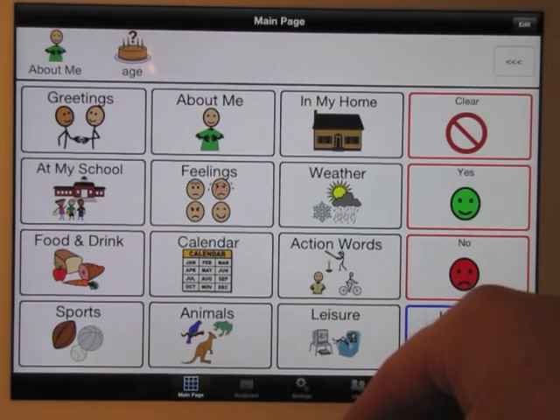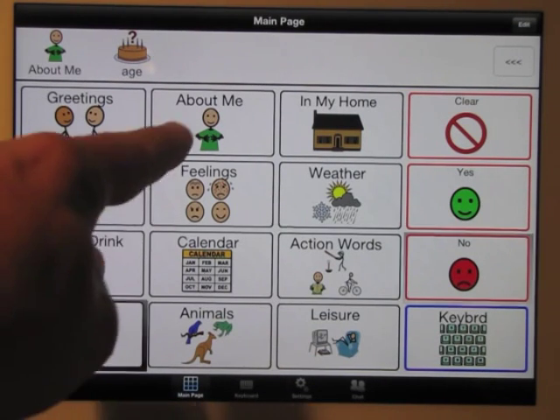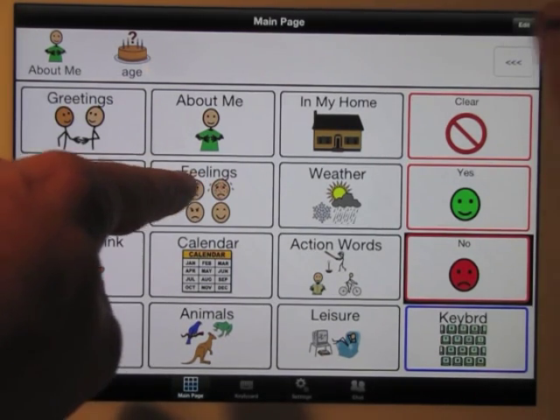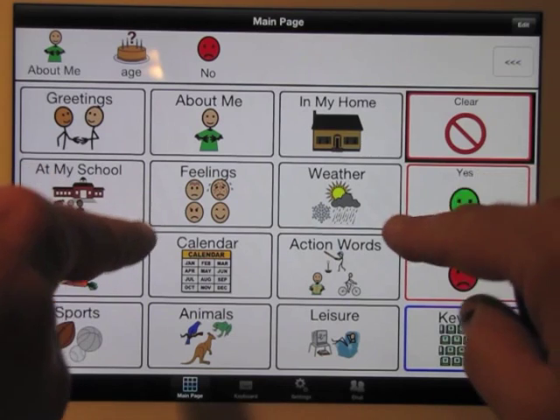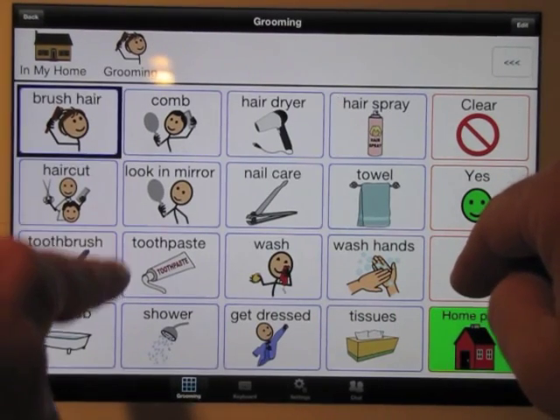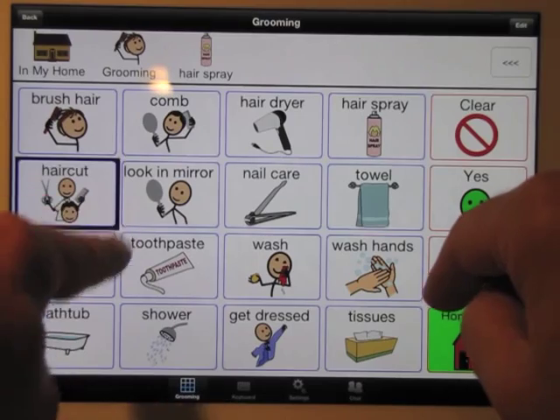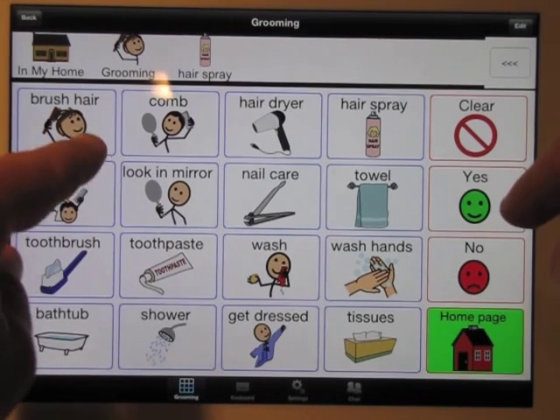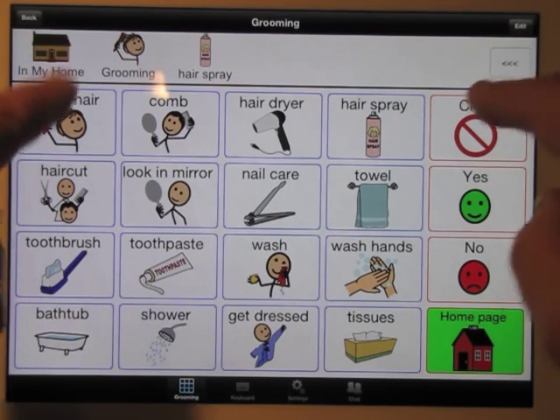My left side is my scan side — I'm doing step scanning using the left side of the page to advance my scanning. I use my right side to choose my selection, just anywhere on the right side. So left side is scan, right side is select. As I go along, if I want to advance I hit anywhere on the left side. When the message bar is highlighted, I simply wait or advance my scan and then select — 'In my home,' 'Grooming,' 'Hairspray.' That was two switch step scanning.